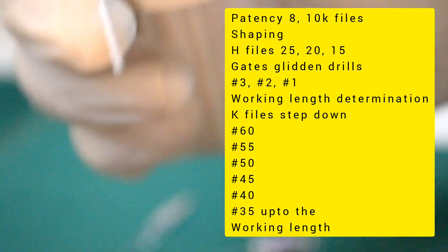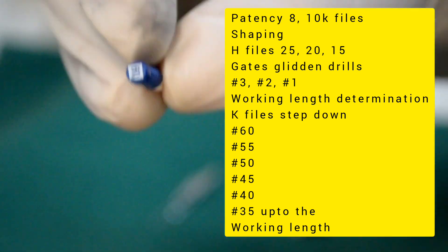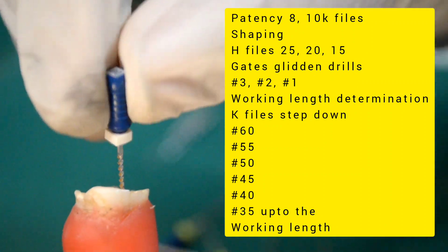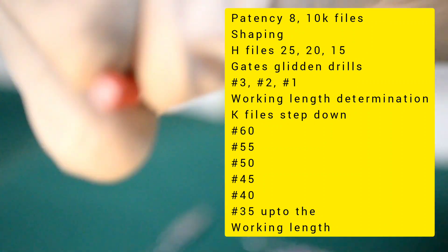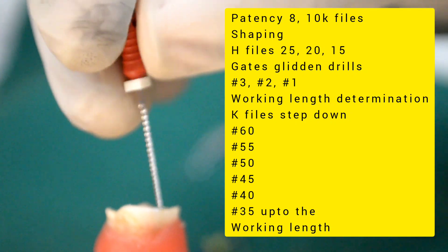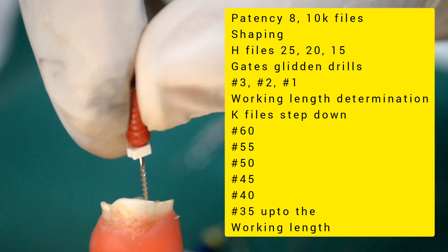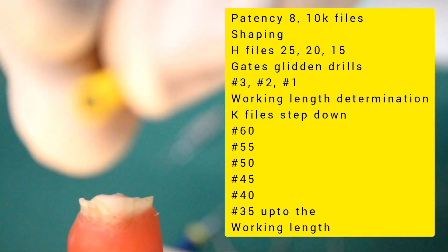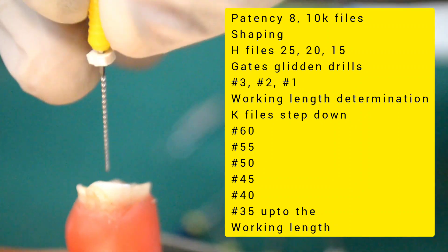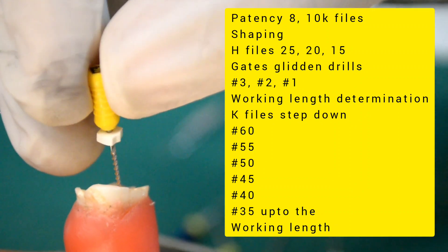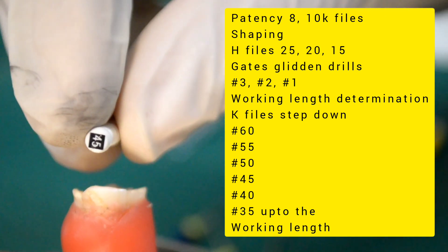Now place a 60K file in a watch winding motion until resistance is met. This is followed by placement of 55K file, next 50K file, in a decreasing order of file sizes until the apex is reached with a master apical K file.